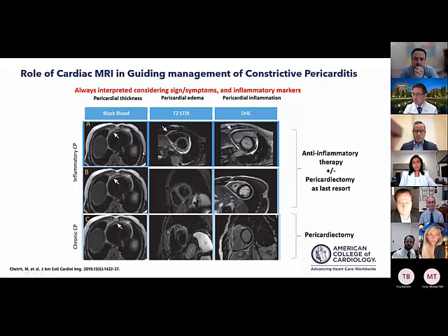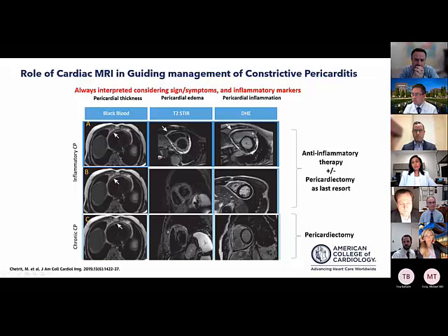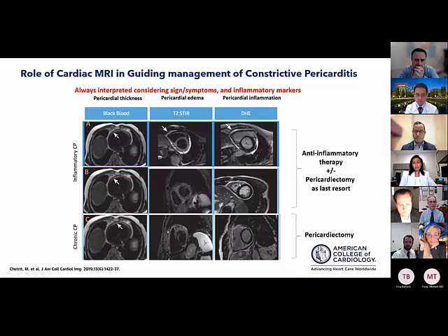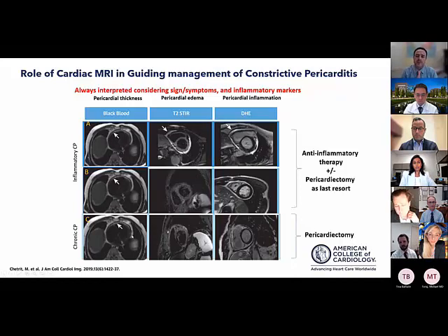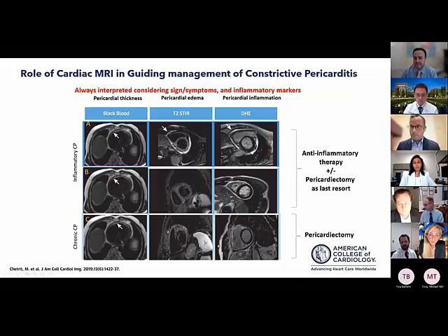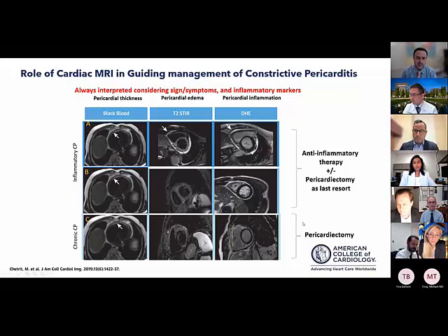Imaging guides management as follows: if there is both T2 signal and LGE suggesting acute inflammation, or significant LGE alone in a subacute process with an important inflammatory component, the patient should receive anti-inflammatory therapies with follow-up. In contrast, if there is none to minimal enhancement and no T2 edema in a patient with overt constriction, pericardectomy should be considered.